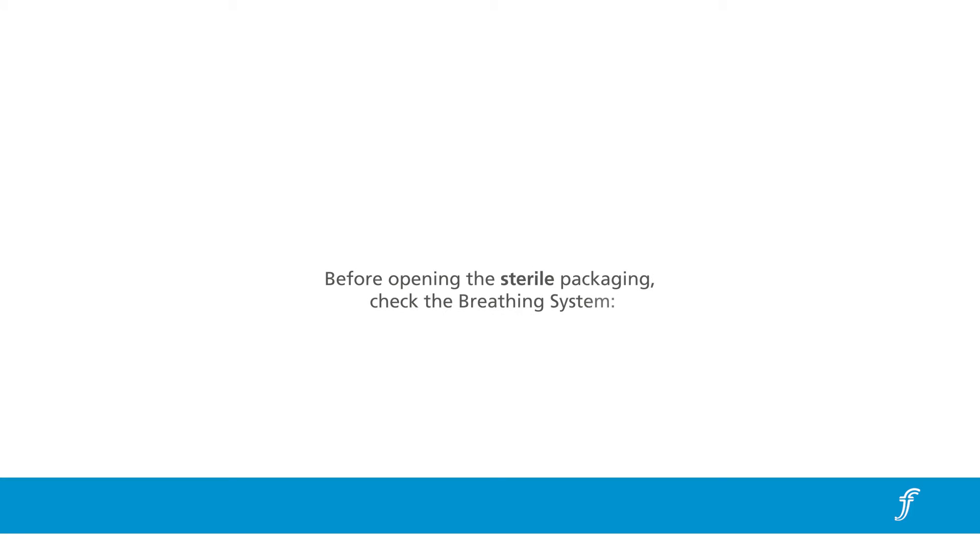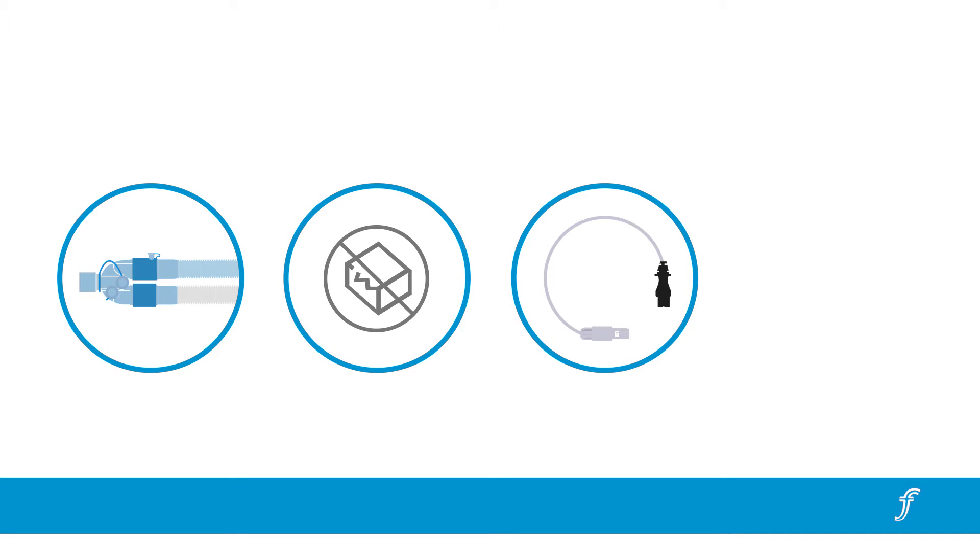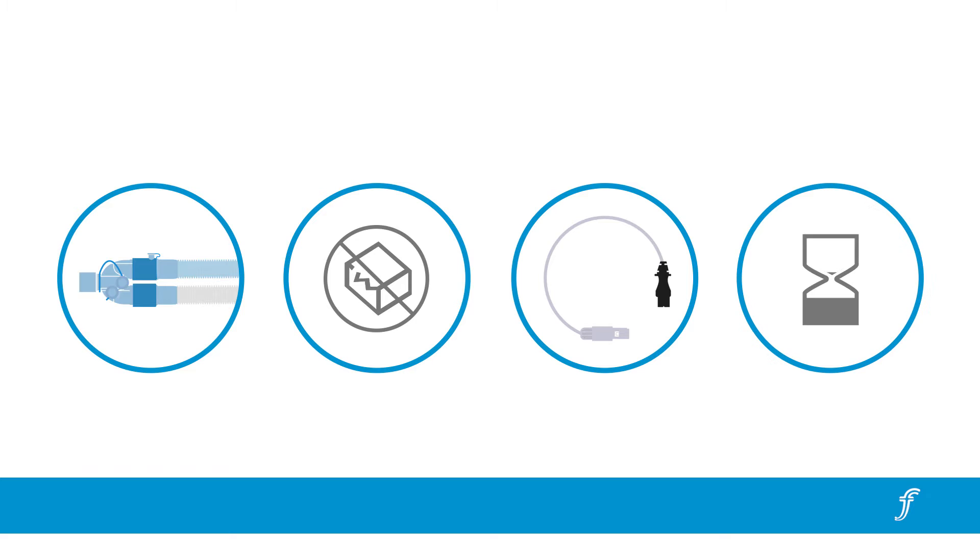Before opening the sterile packaging, check that the breathing system is the correct type, the packaging is not open or damaged, all parts are present and intact, and the expiry date has not passed.